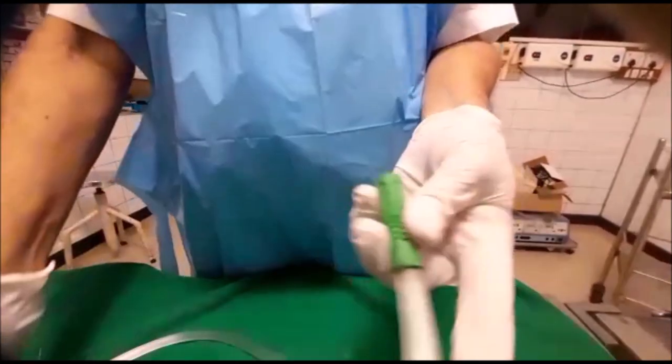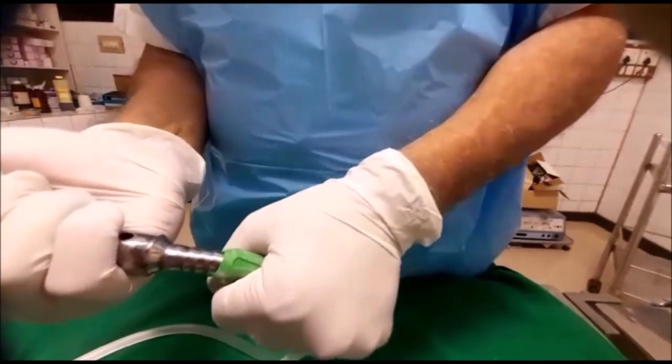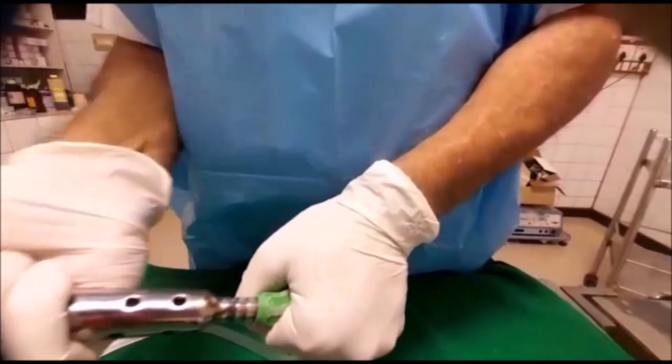After this you can remove this. Now you can insert the cannula like this. See, it is nicely going — not difficult.